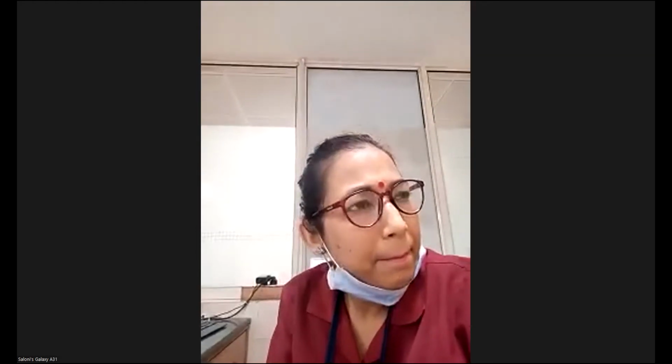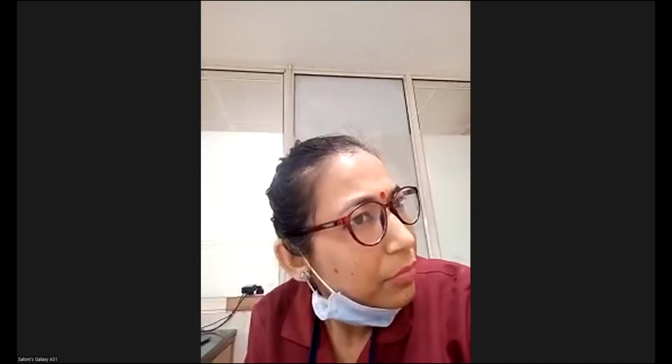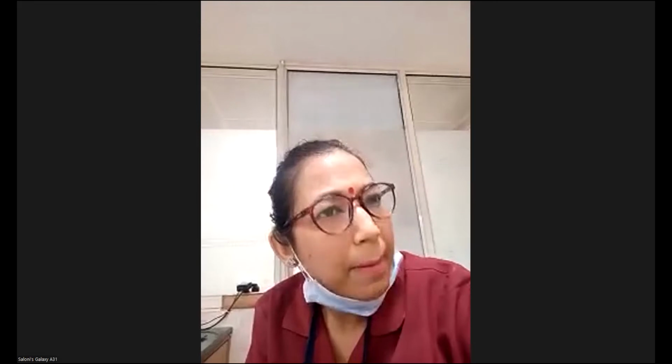But about the fluids, it has to be regulated based on the swelling. There should be minimal swelling, which means the fluid entering underneath the skin is safe and high volumes are not being introduced. If you find that there is a huge swelling, you have to reduce the speed of the volume which is entering. That's the only thing. Okay, thank you, sir. Thank you.